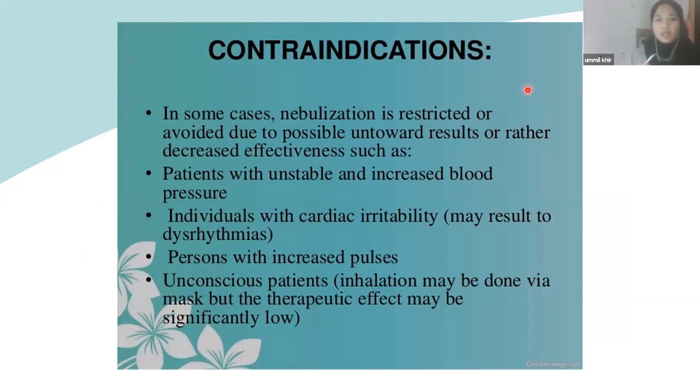Contraindication for nebulization. In some cases, nebulization is restricted or needs to be avoided because there is a possible untoward result or there is less effectiveness of nebulization for that patient. For example, patients with unstable and increased blood pressure, or those with cardiac irritability, because nebulization may result in arrhythmia, and then those with increased pulse and unconscious patients.